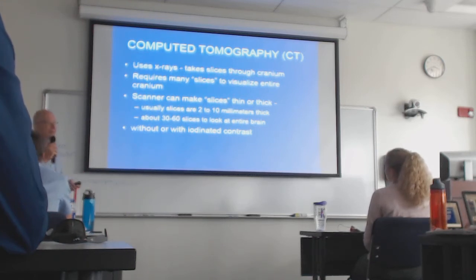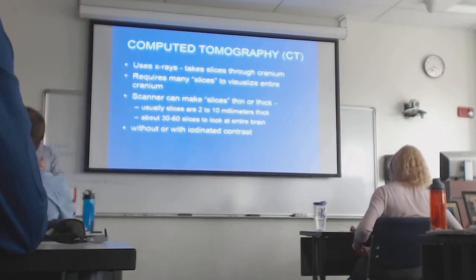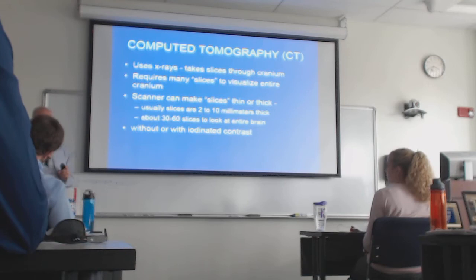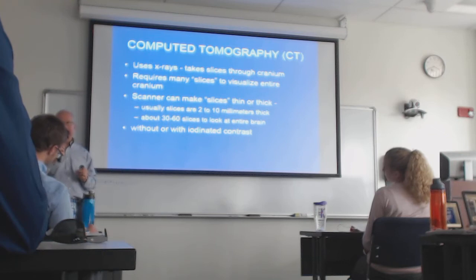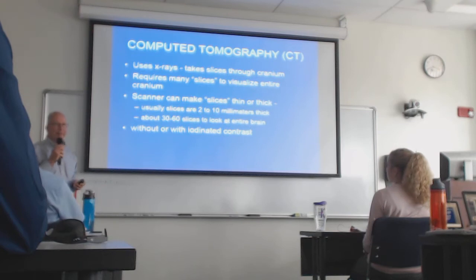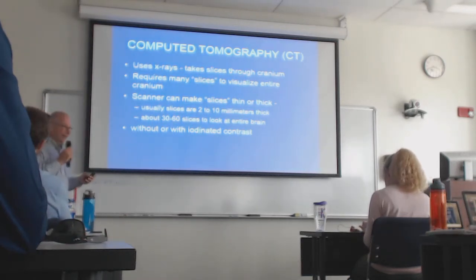The first commercially available head CT scanners were only head CTs. You could only get a human head in it, couldn't get the whole body in it. And the slice thicknesses were 10 or 20 millimeters. Today we do slice thicknesses of 3 millimeters, 1 millimeter, even smaller. A single slice took 10 minutes of computing power to create. Now we can do a whole head CT in 5 seconds. So just an idea of the scale of the computing and the technology that's come.